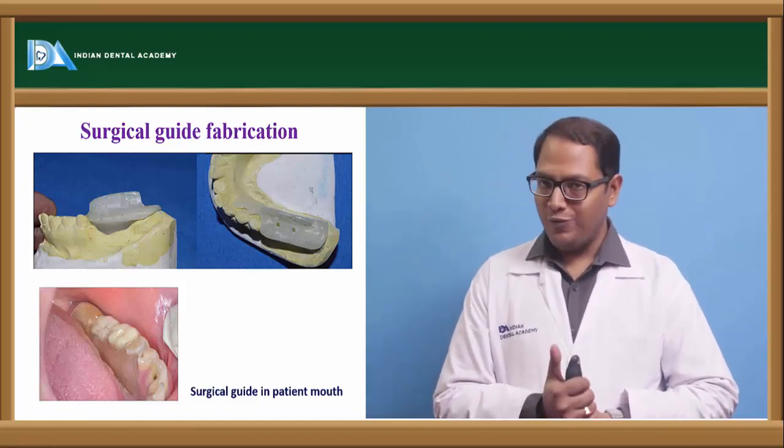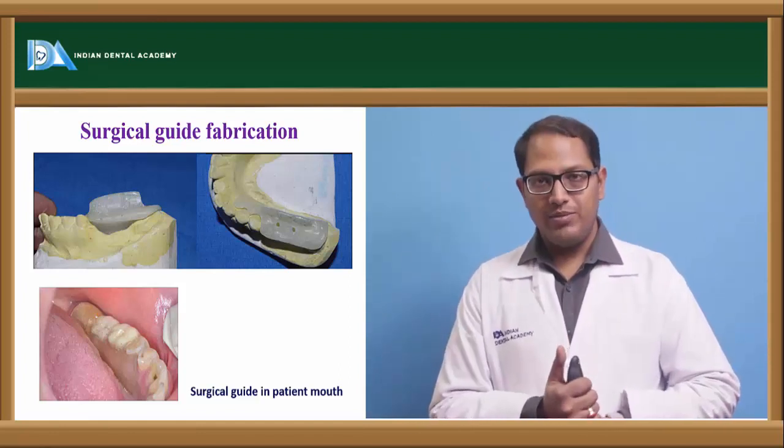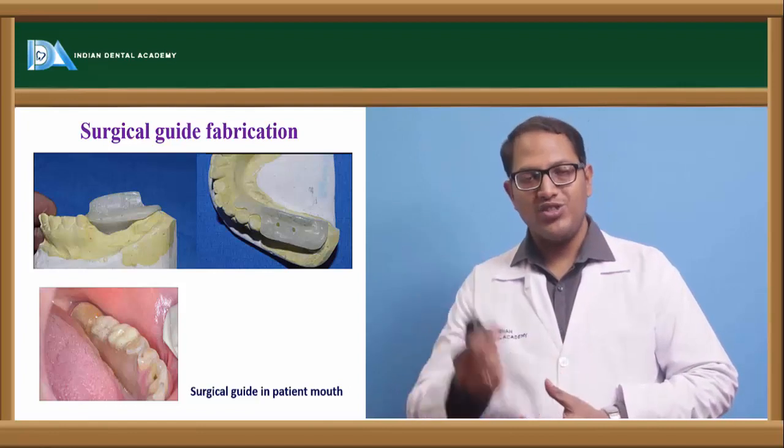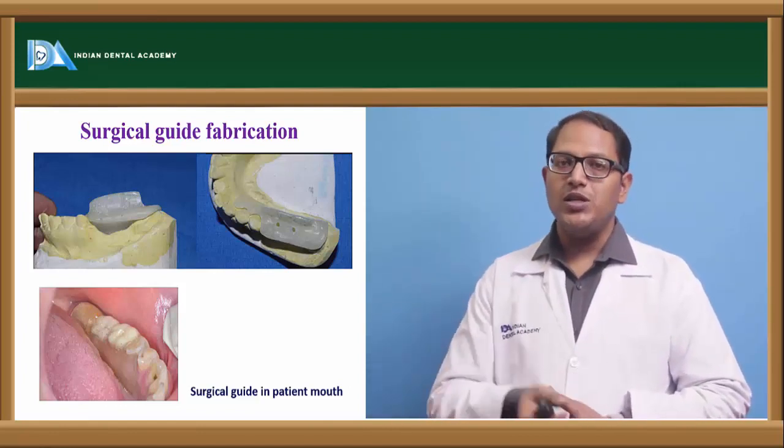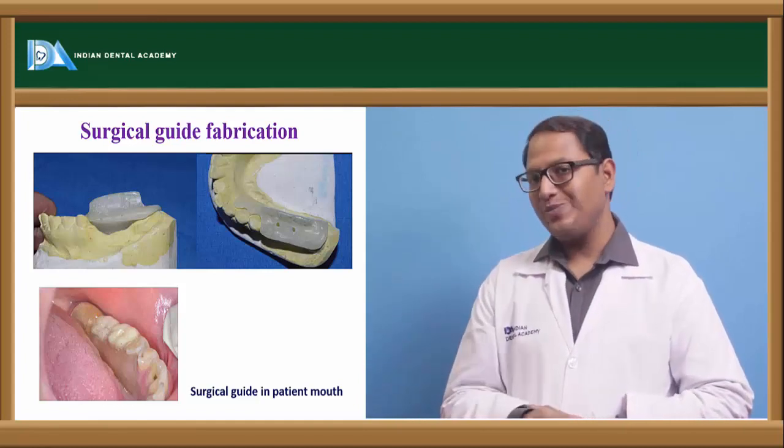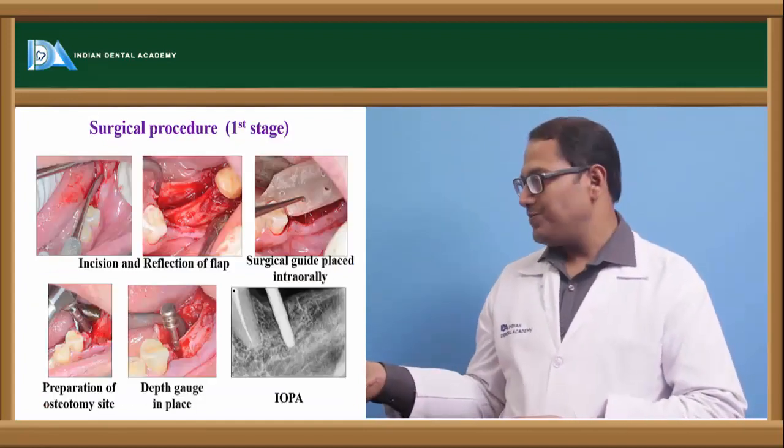It serves two purposes. One is at the time of making the OPG, if you have a surgical guide, you will exactly know where the placement is, and while placement also, it will direct your drill in the exact position and you will not go wrong.